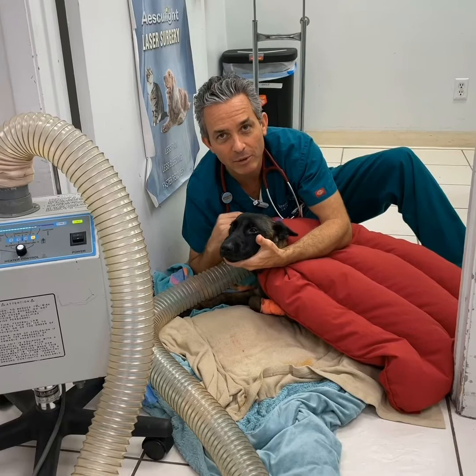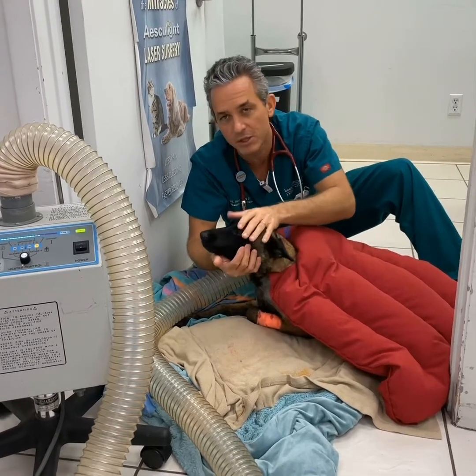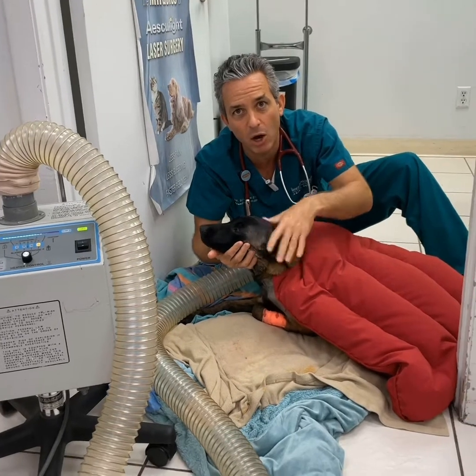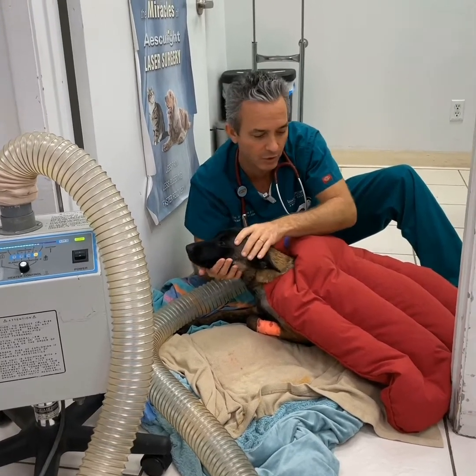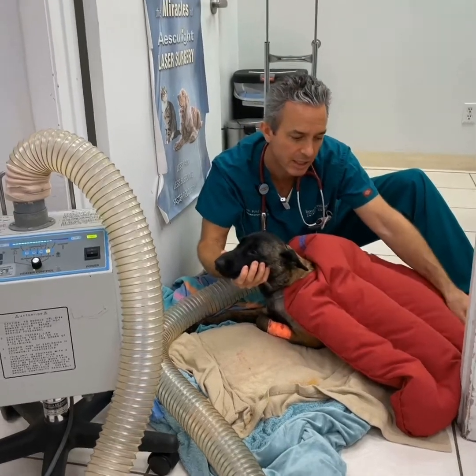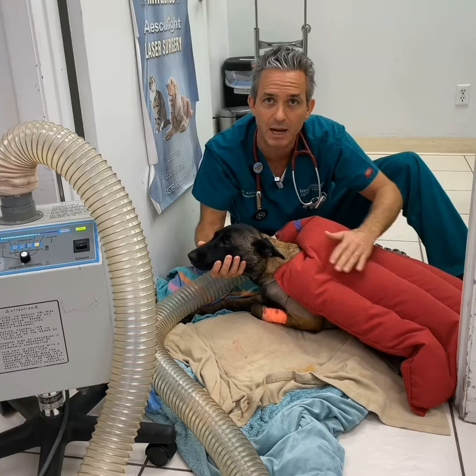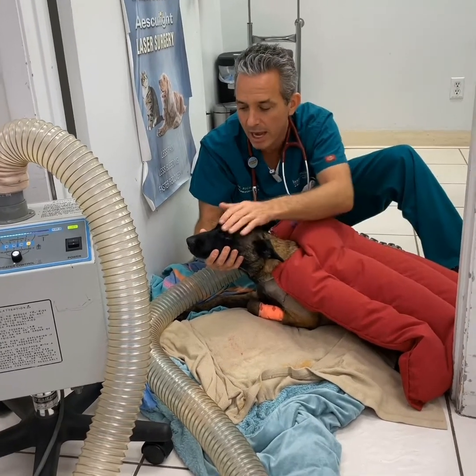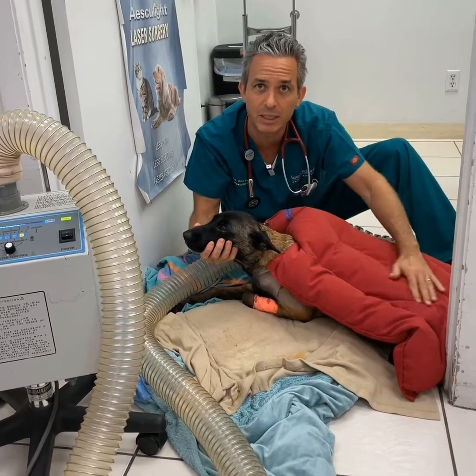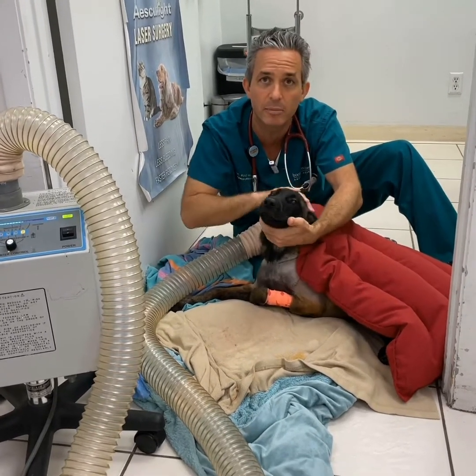Kaya is now recovering from her procedure and she's doing well. She's a little bit cold despite being on a heated surgery table, so we recover our patients with this bear hugger — it's full of hot air to help keep her temperature as high as possible. We're waiting until her temperature reaches at least 99 degrees Fahrenheit before we feel good about her being warm.